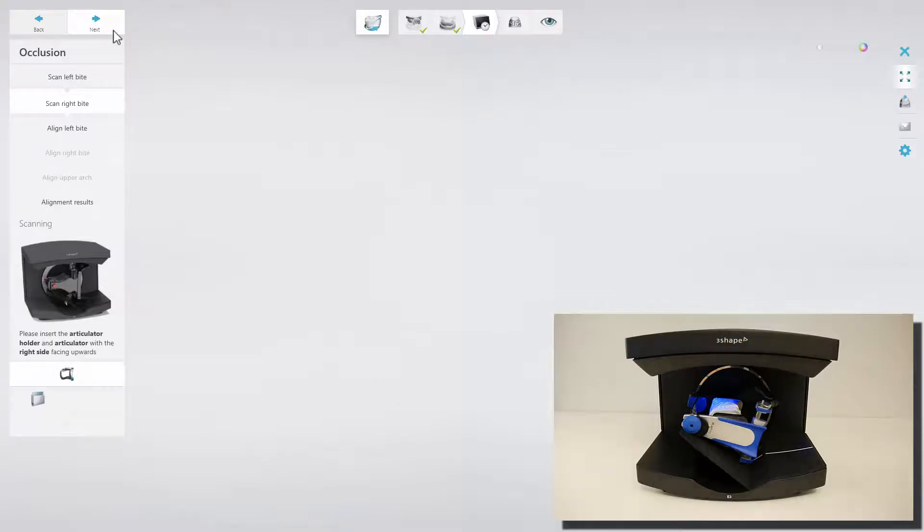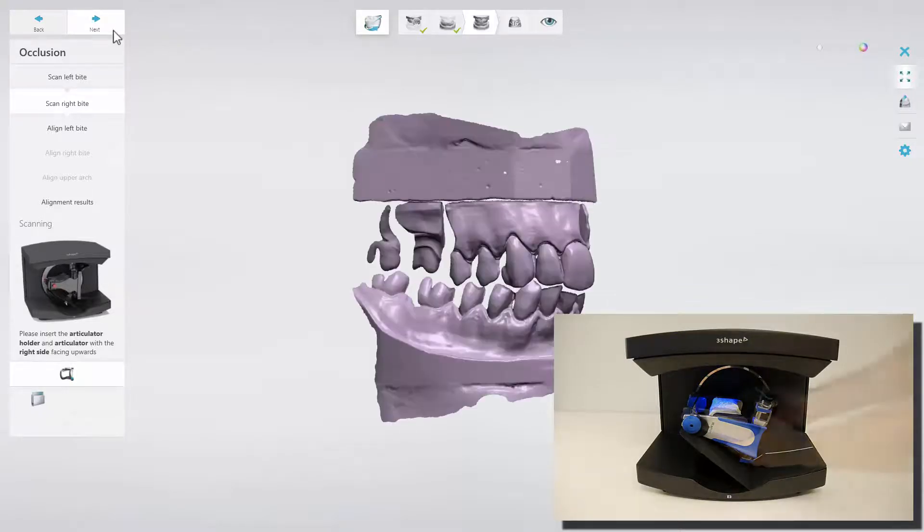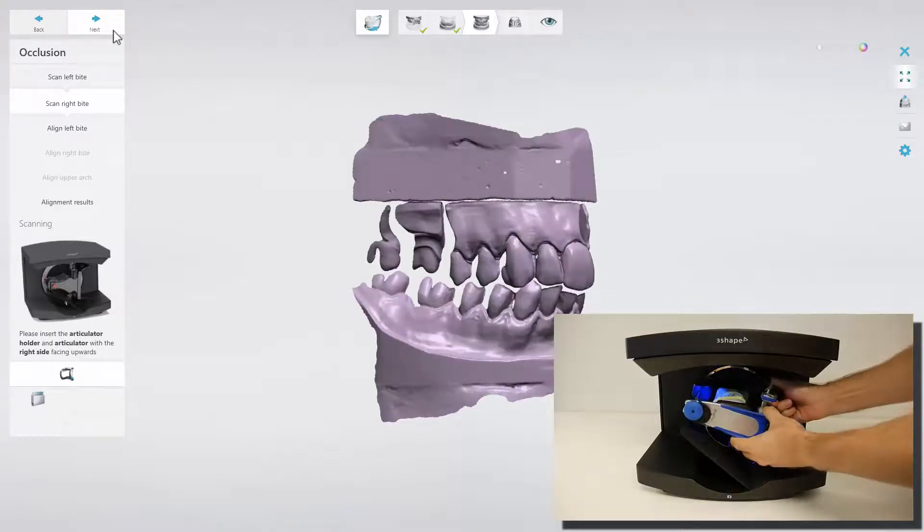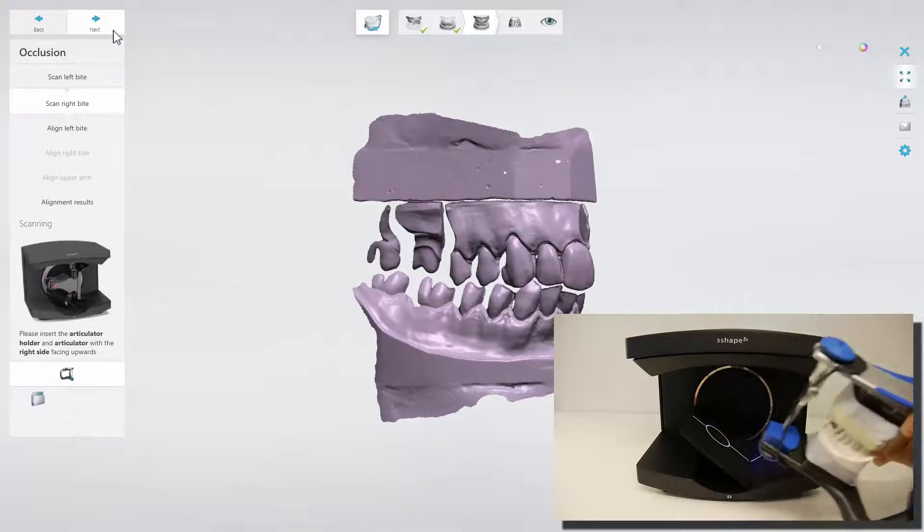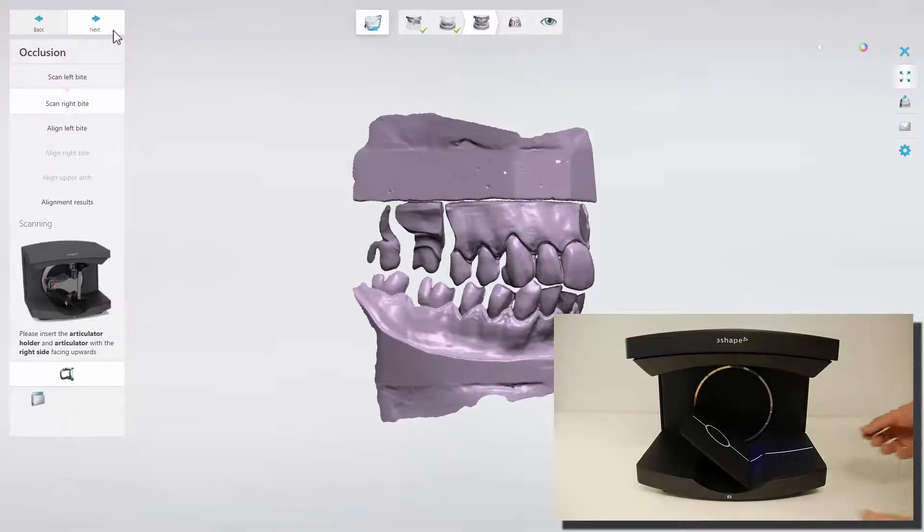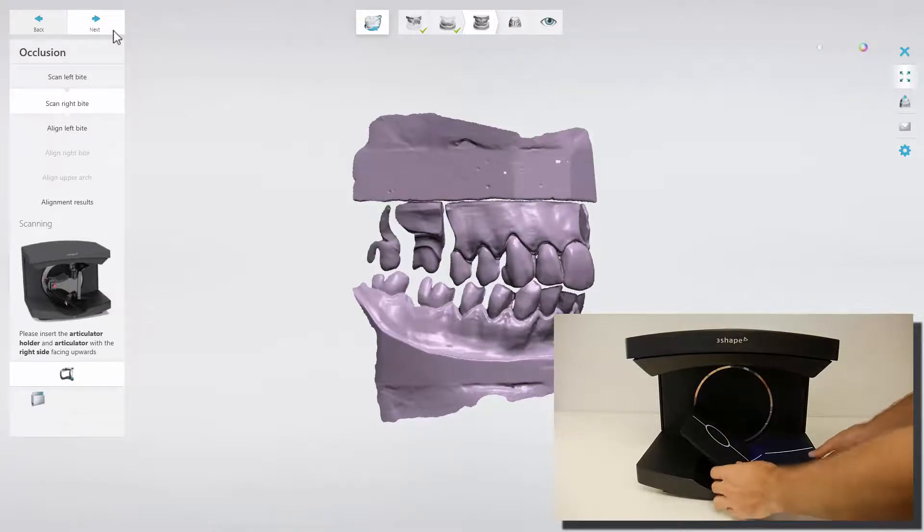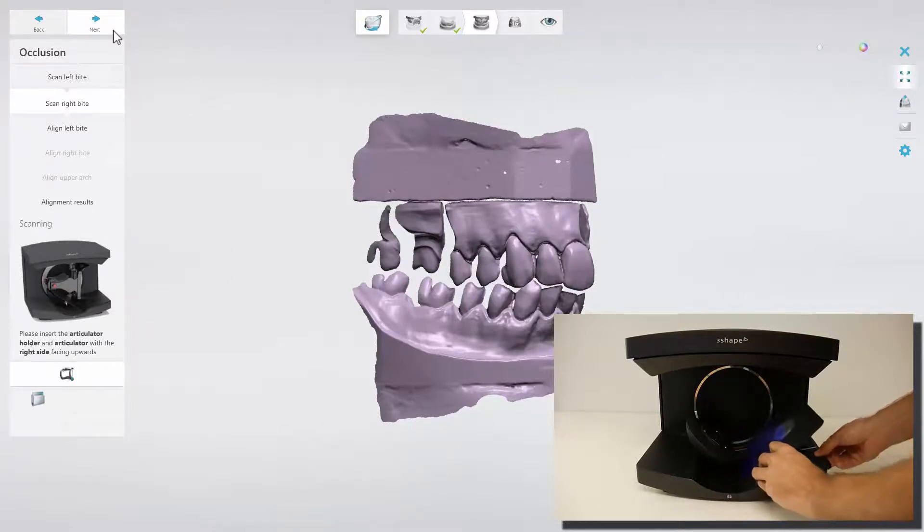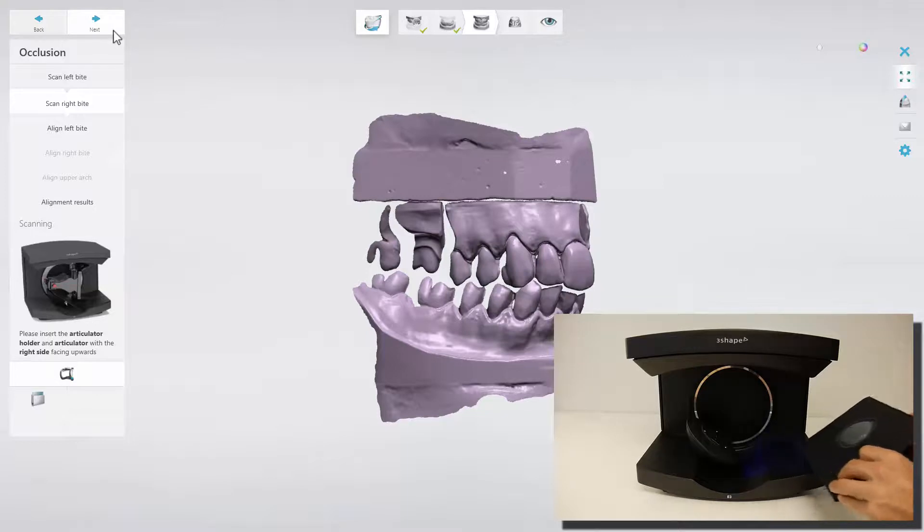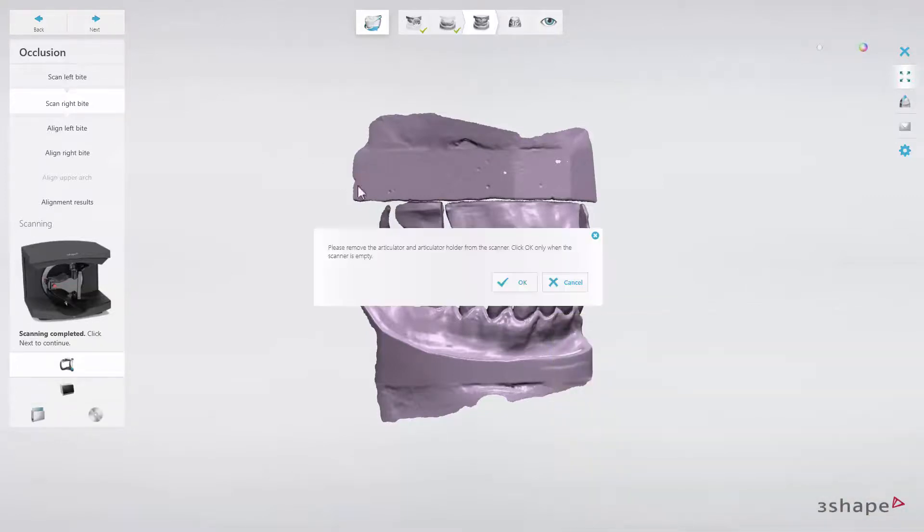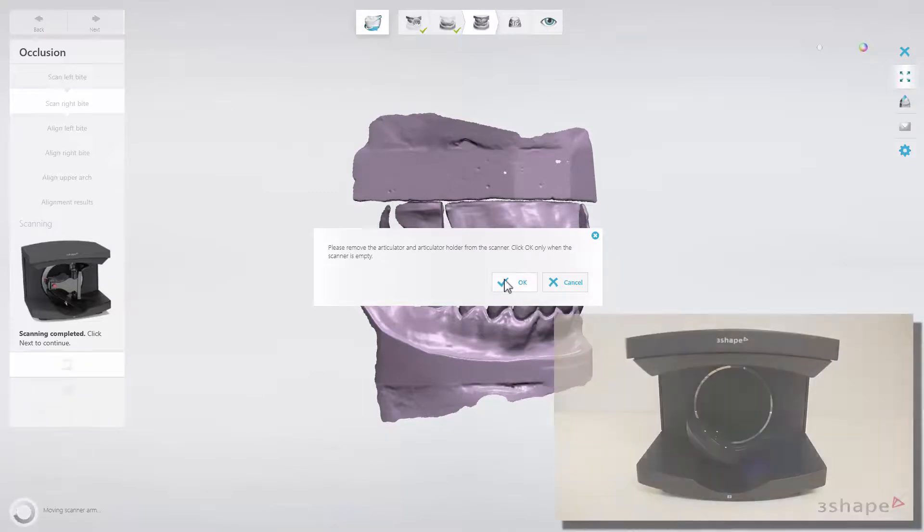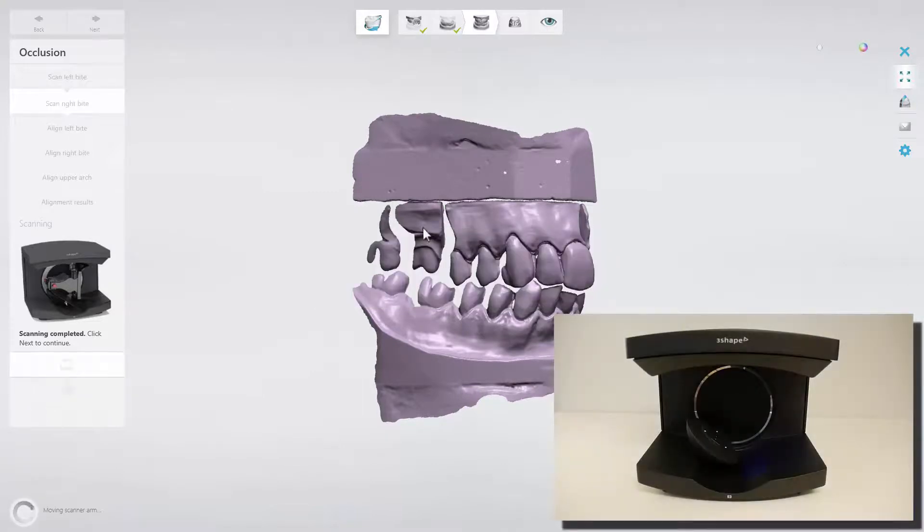When the scanning process of the right side bite is completed, remove the Articulator and the Articulator Holder from the scanner. Then click Next and OK to confirm that the scanner is empty.